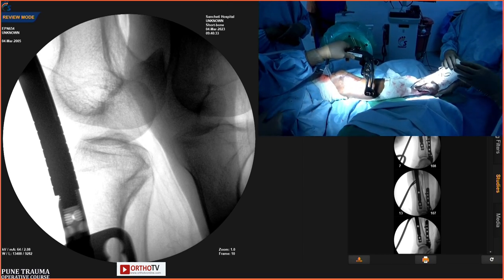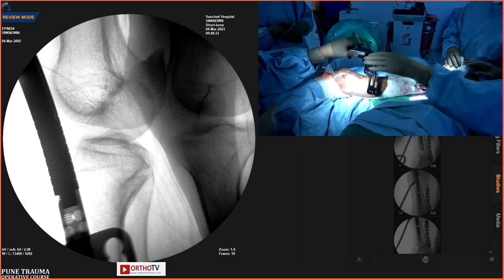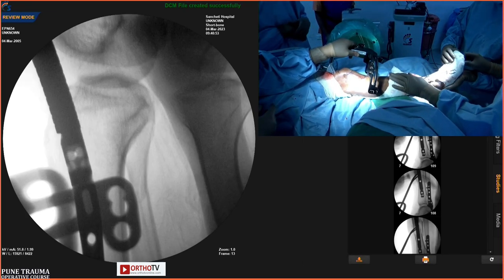Okay, now we will start locking. First we will do a distal locking, and then a proximal locking.